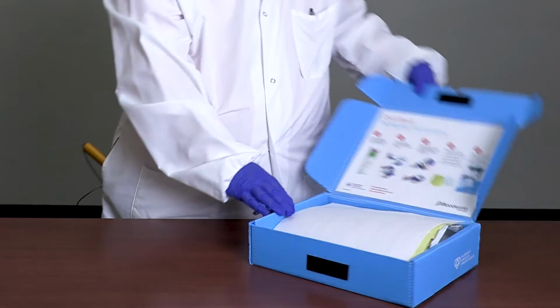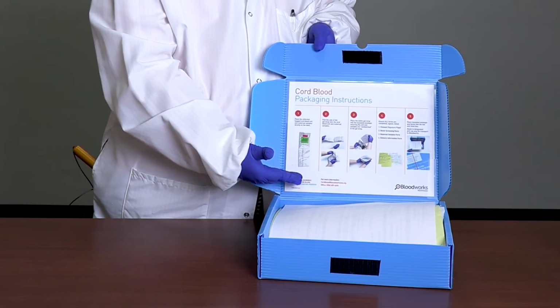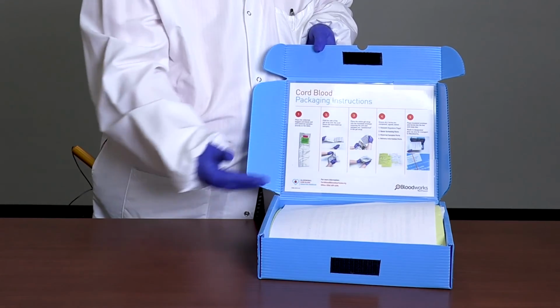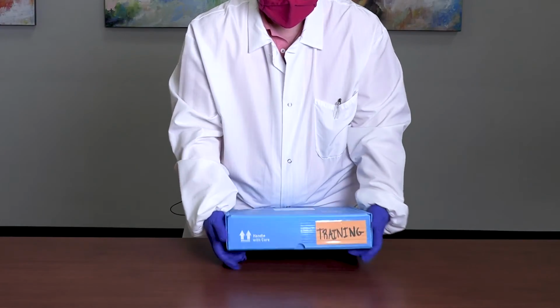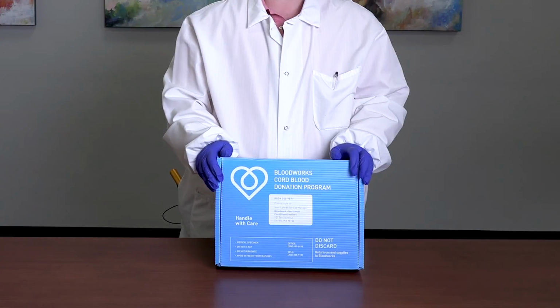If you need a reminder on packaging, there's packaging instructions that are included on the back of the collection box. This kit will be closed up and then returned to the appropriate site at your hospital to be picked up by our couriers during their daily run.